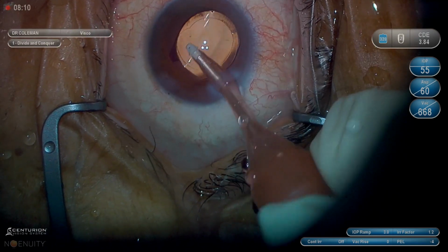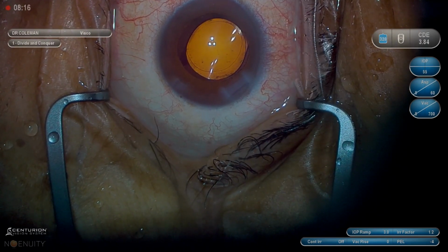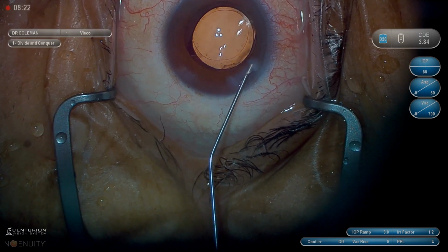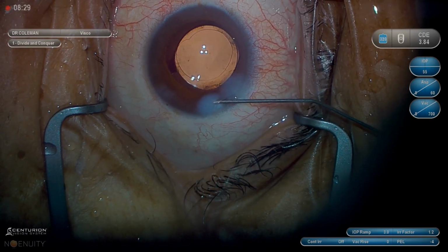Is it absolutely necessary to go behind the lens? I don't think it is, but if you're more than 100 cases in, I think that's the time that a resident should start going behind the lens to get the viscoelastic out, because especially with a toric, it's going to give you a pivot point to rotate on. I think it's more likely for a toric to rotate if you don't get adequate viscoelastic removal. So I think going behind the lens is a good idea.